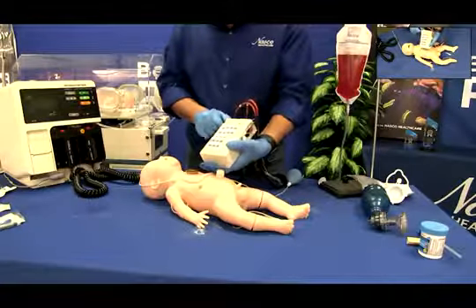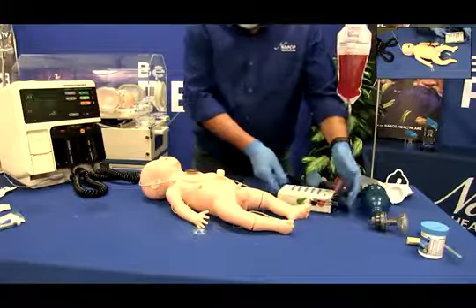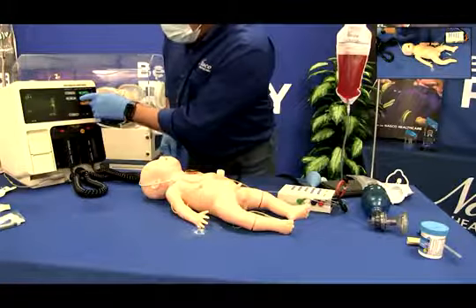Shock the mannequin using industry standards for infant defibrillation. Using 20 joules of energy is enough to convert, and do not go over the industry standard.